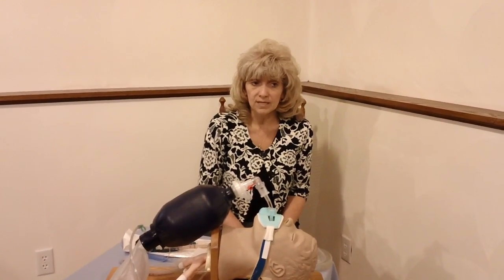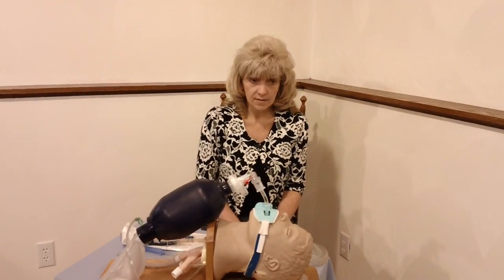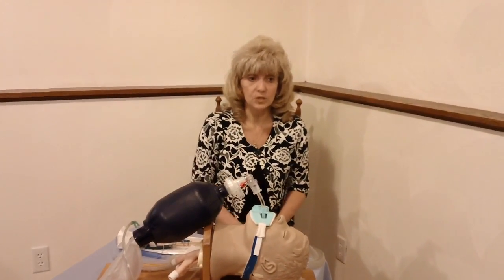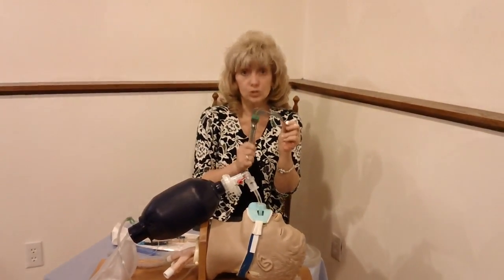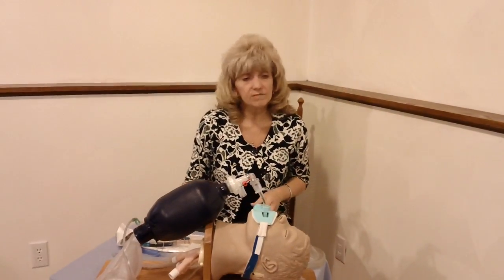We need syringes, a 5 to 10 cc syringe to inflate the bulb on the endotracheal tube. We need lubricant and an oropharyngeal airway, which is a rigid airway that we would need to keep the tongue displaced and out of the way when we try to intubate. We would need laryngoscopes. We could use the curved blade, which is the Macintosh, or we could use the straight blade, which is the Miller blade. These do come in different sizes.